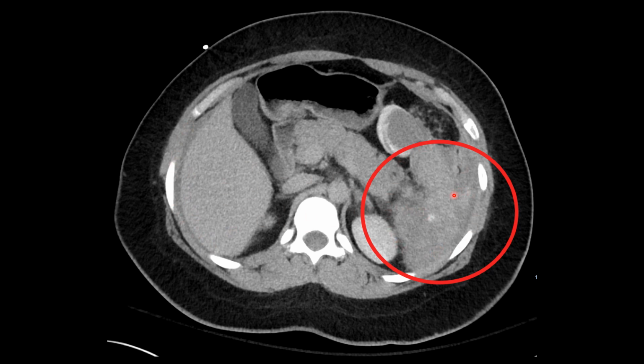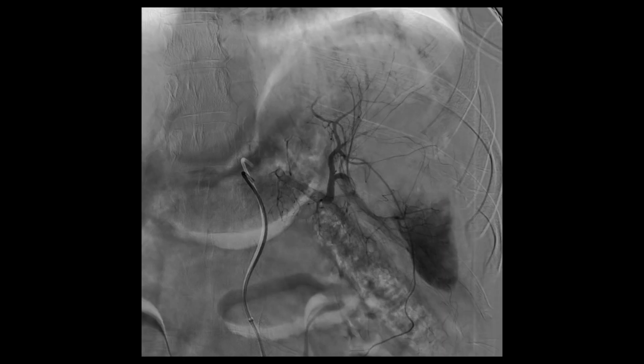So our spleen is not really enhancing correctly. It should kind of look like the liver, and it's not. So there's some fluid, probably hemorrhage here, and then we have this lone bright spot, which is concerning for possibly active hemorrhage. So we took him to angiography, and we did a proximal, or this would be a splenic artery angiogram, and it is markedly abnormal.